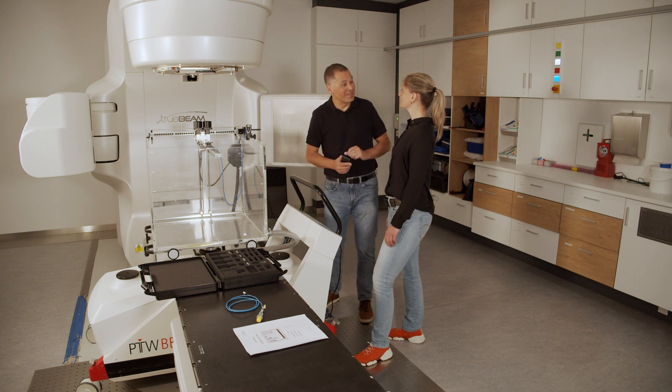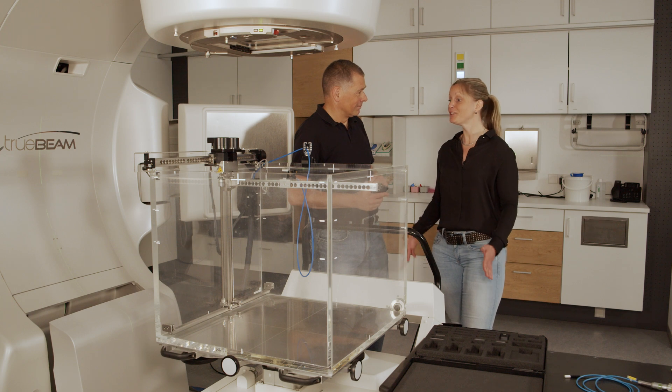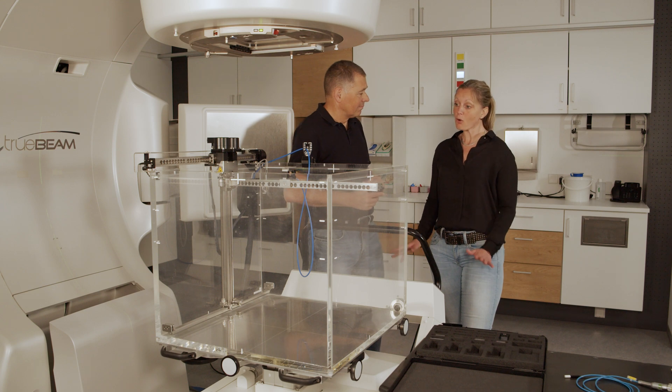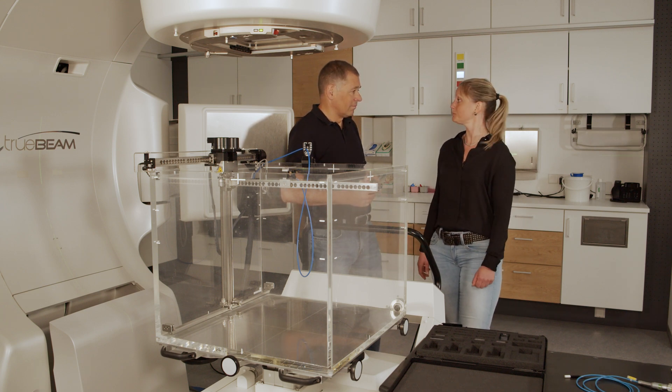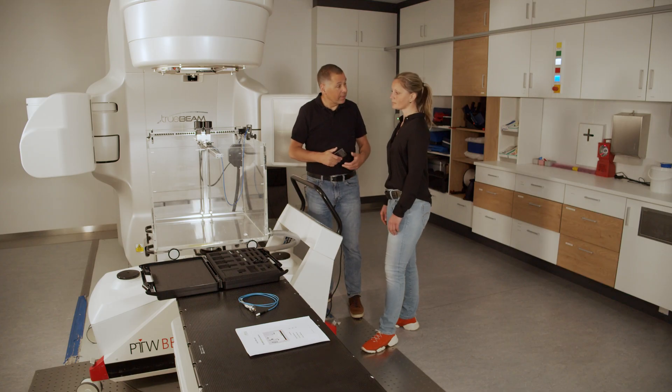And now we have to set a zero point like in the past. This is a BeamScan — you don't have to set a zero point during the auto setup. So don't mess it up. You only have to install the detector you want to use. Okay, we leave the zero point. So let's mount the detector.